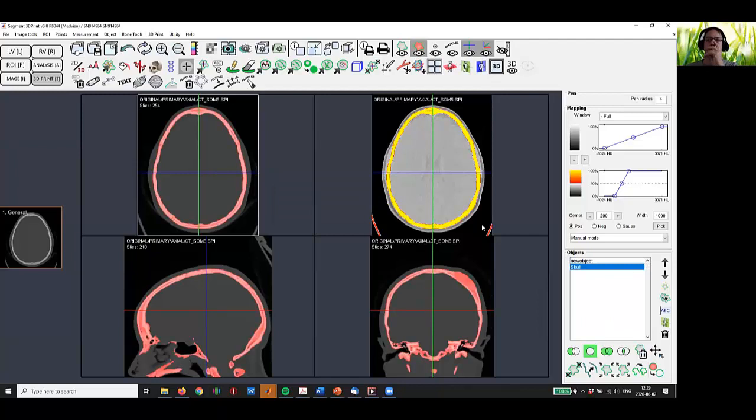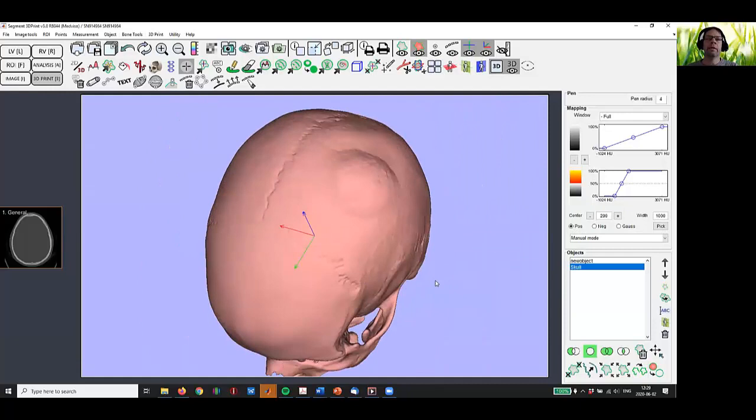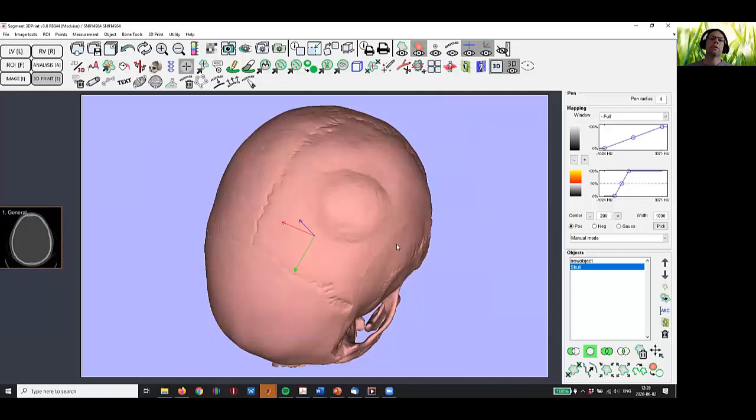And here we can see this case, and this is an osteoma. So what we want to do is take away this part, and then we need to remove that part so we cannot put it back. So we need to make a mold.